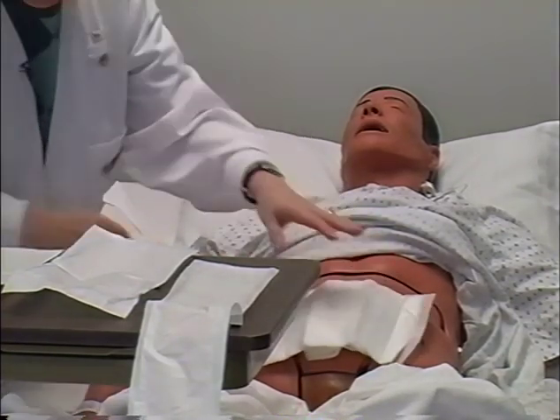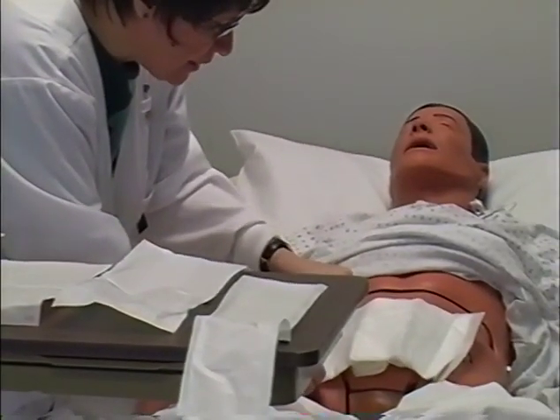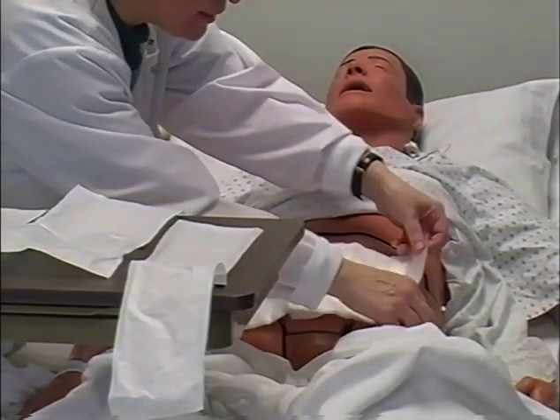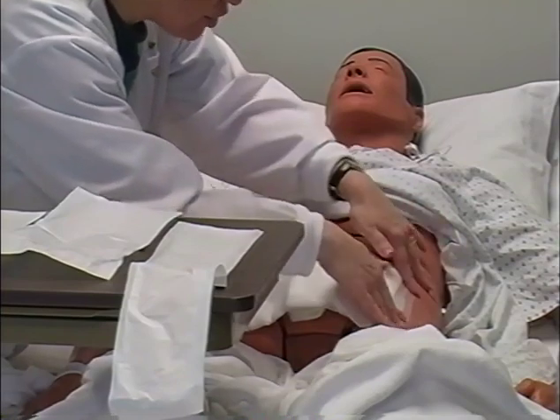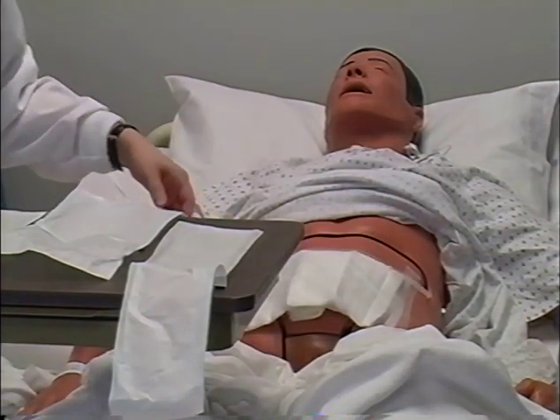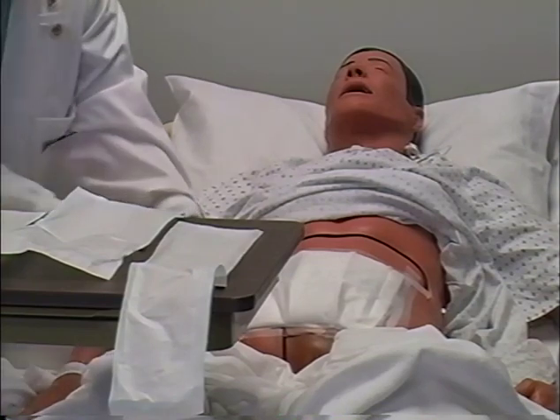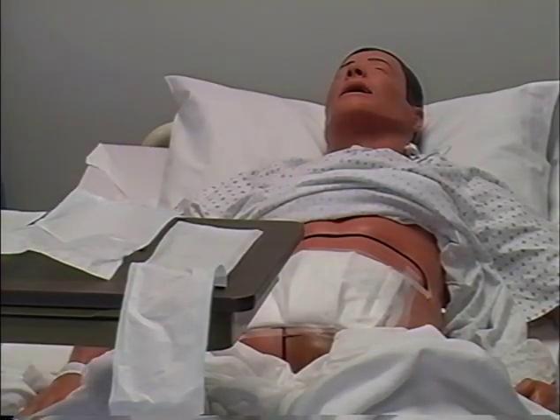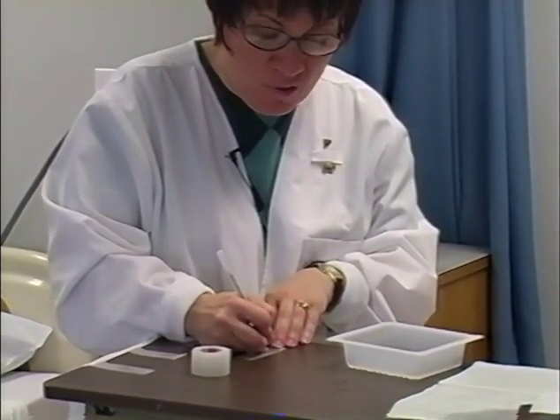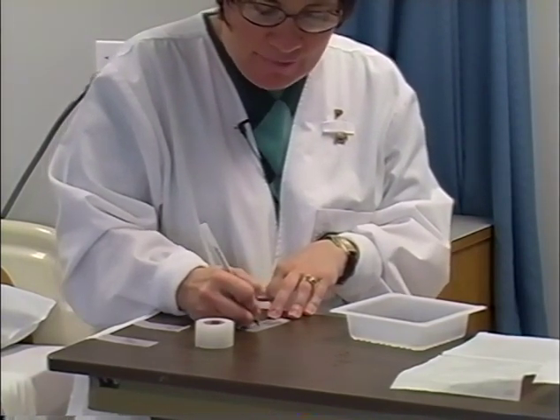Once I lay down my abdominal dressing, I can't move it or I would be contaminating the field. I'm just going to secure the dressing and tape it down. I'm going to tape it in the fashion of a windowpane, so there will be tape on all four edges, since she has a drain — this will prevent any drainage from running down her leg. The very last thing I need to do is to take a piece of tape, put today's date, the time, and my initials on it, and then put it right over the center of the dressing so the next nurse will know the exact time that Mrs. Lewis had her dressing changed. I need to write date, time, and initials on the top of the over-the-bed table — not on her abdomen, which wouldn't feel very comfortable.